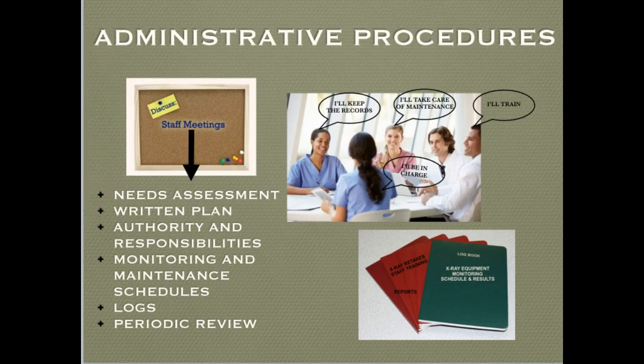So one aspect is to develop a needs assessment, where your staff or the dental staff can meet either monthly or quarterly to determine what we need to do in order to have high quality diagnostic images and work within the principle of ALARA, as low as reasonably achievable, when utilizing dental x-rays.